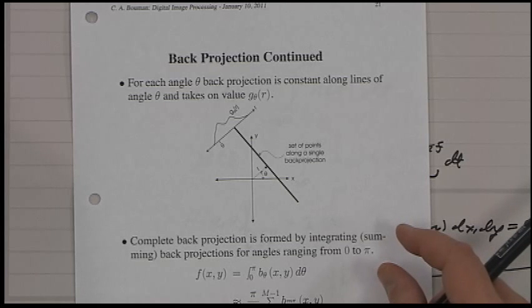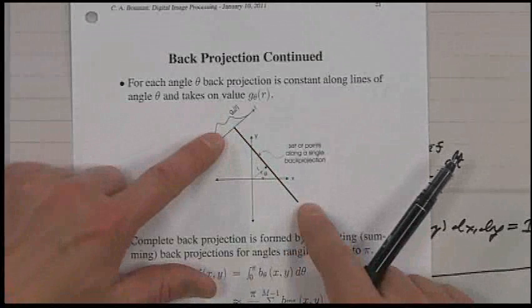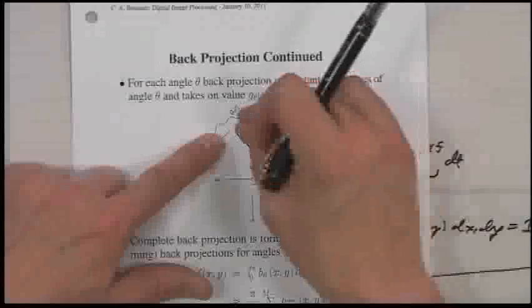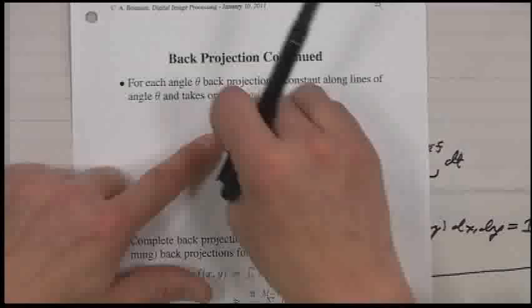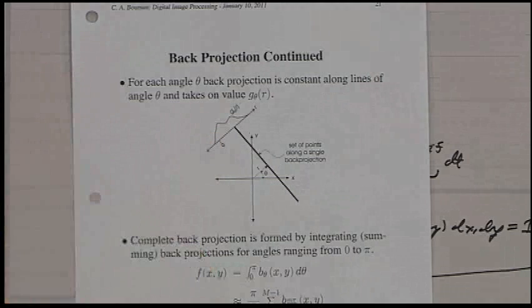In the forward projection, you add all these variables together. In the back projection, you take some value and you proportionately put it at each location in proportion to the additive weight you used to add it up in the first place. So they're transpose operations. The range becomes a domain, and the domain becomes a range.